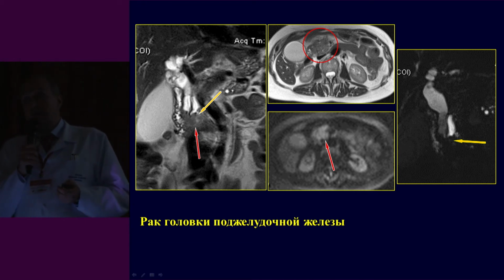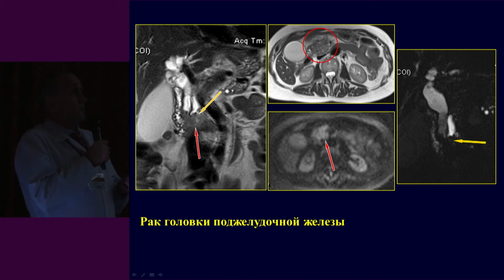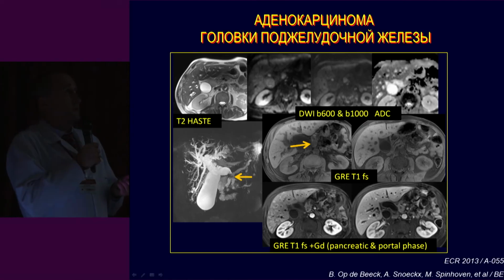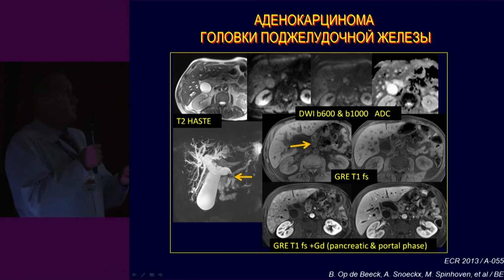At the moment, the diagnostic potential of the MRI, we can use the diffusion weighted protocols or sequences, and if you have in your setting such diagnostic modalities, then you can see that this method somehow resembles radio isotopic. And if DWI protocol is not used, then please send your specialists to educational courses and the professional development courses, because the DWI methods can reflect all the changes and lesions which could not be differentiated previously on MRI, and even dynamically contrasted MRI.